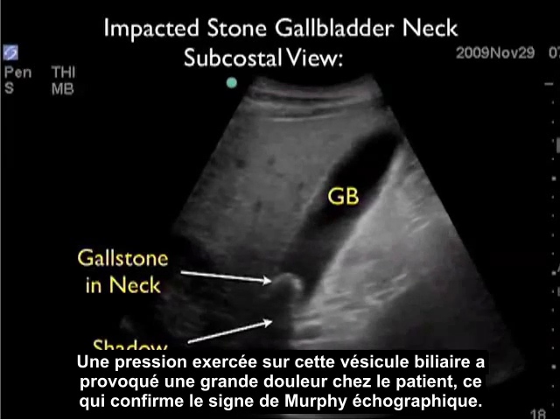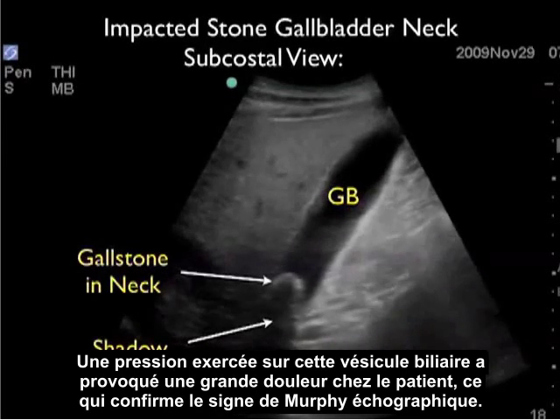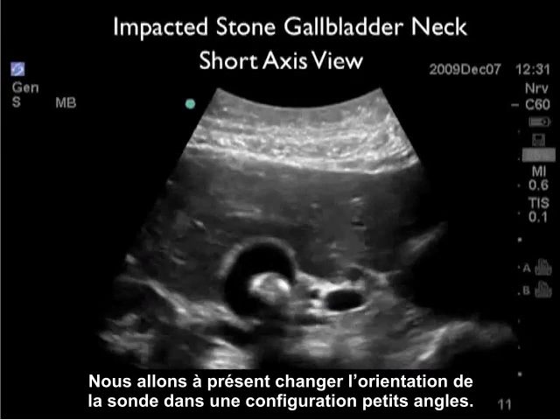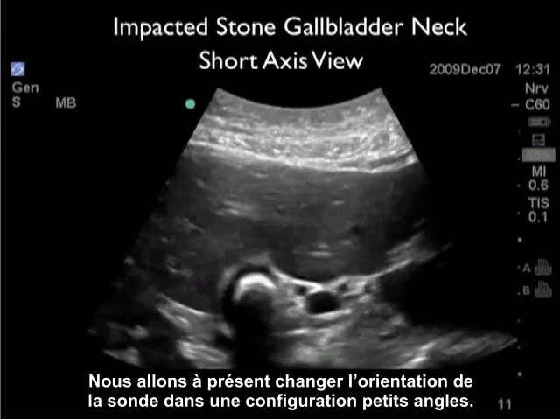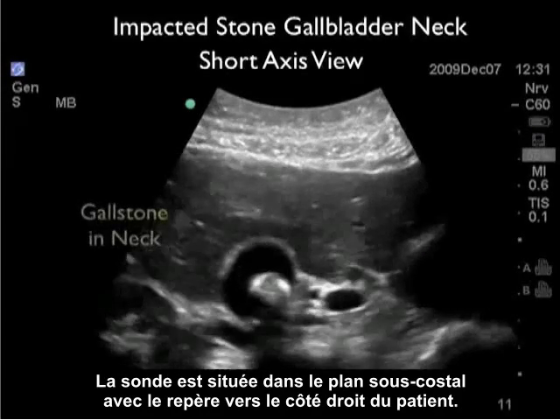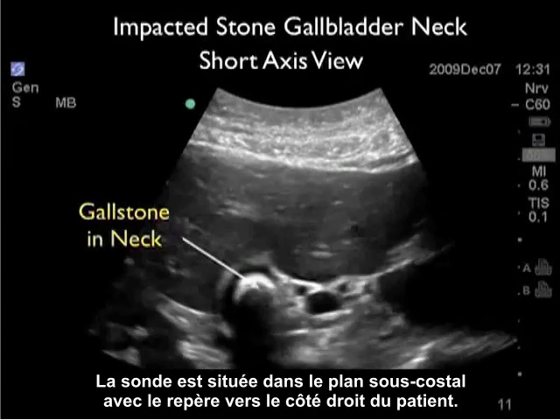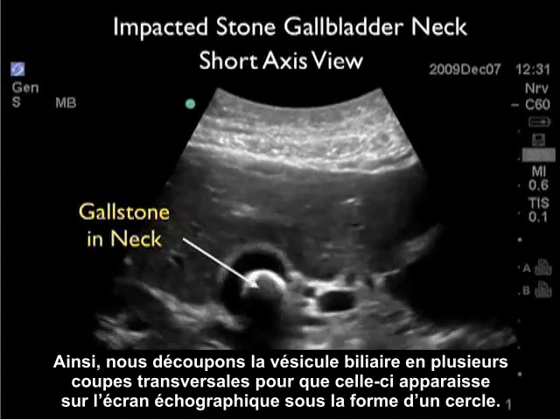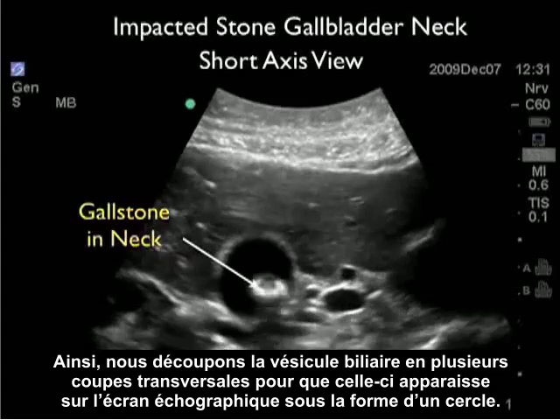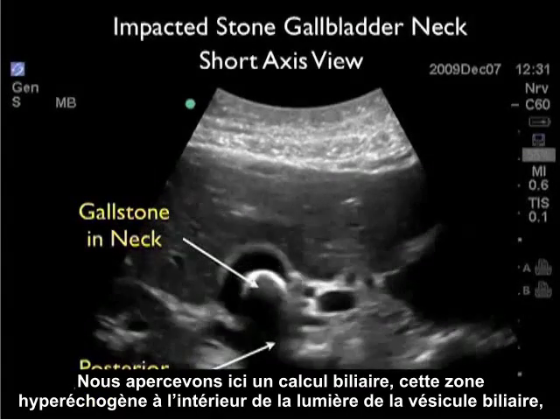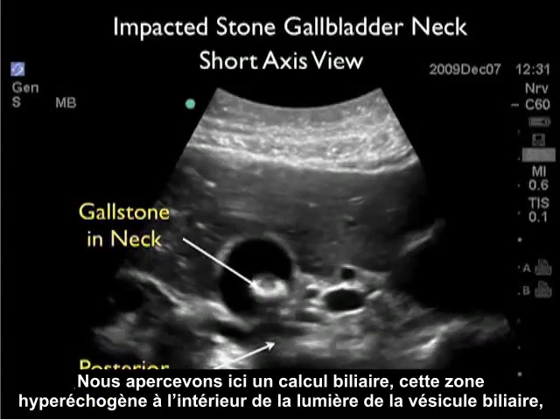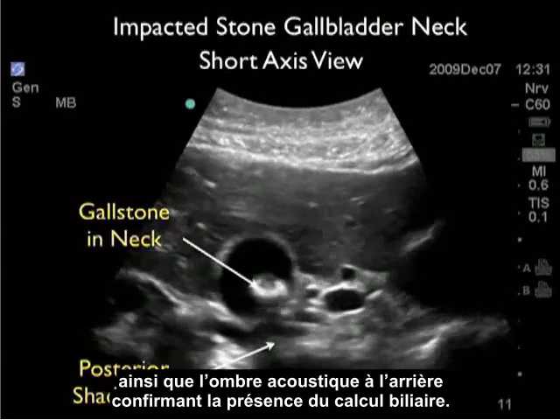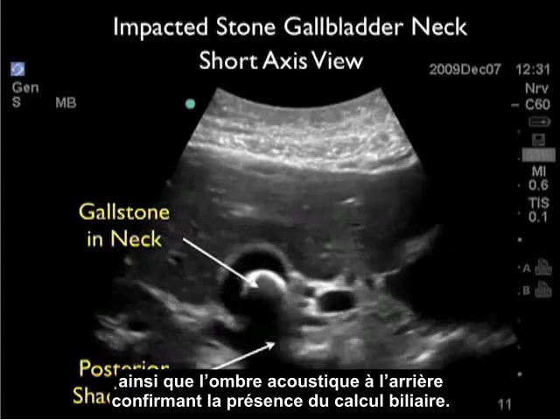As we pressed down on this gallbladder, the patient had a lot of pain, confirming a sonographic Murphy's sign. We then changed the probe orientation into a short axis configuration, located in the subcostal plane with the marker towards the patient's right, cutting the gallbladder into cross sections so it appears as a circle on the ultrasound screen. We see the hyperechoic gallstone within the gallbladder lumen with posterior acoustic shadowing confirming the presence of a gallstone.